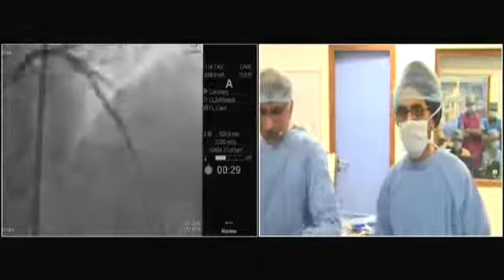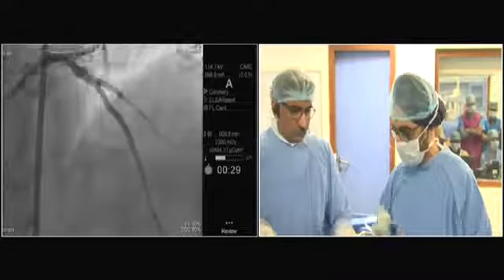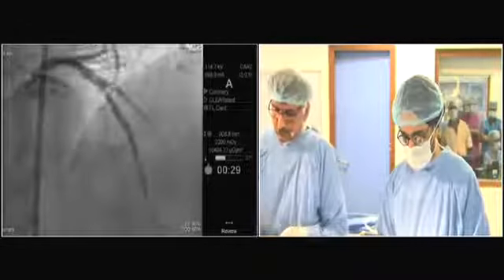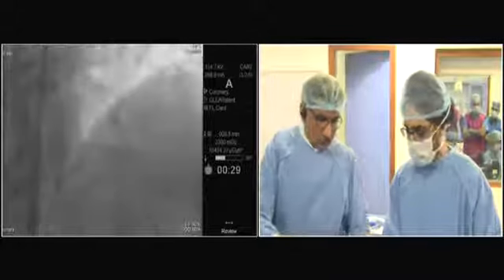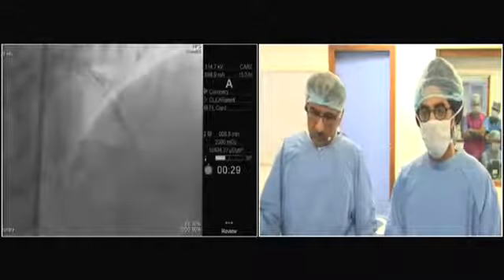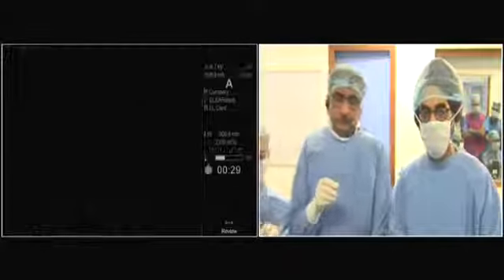Which kind of stent you have? This is Xience Alpine. What stent you have? Xience, yeah. So at 3.0 you can push up to 4. Yeah. More than 4 will be probably difficult.